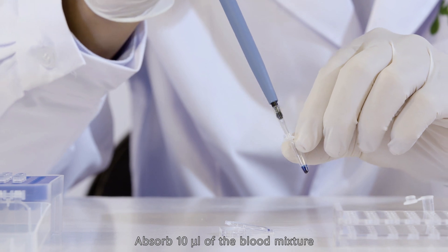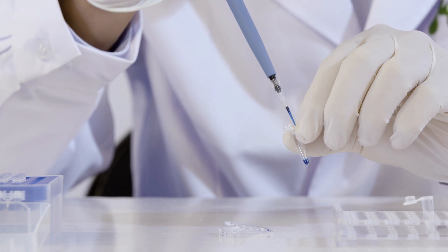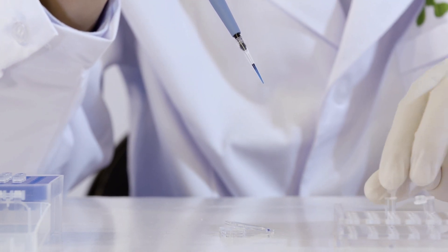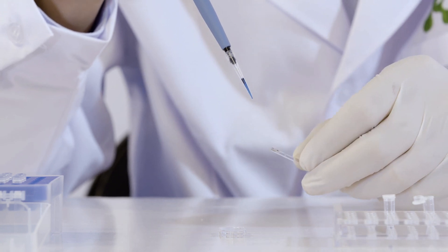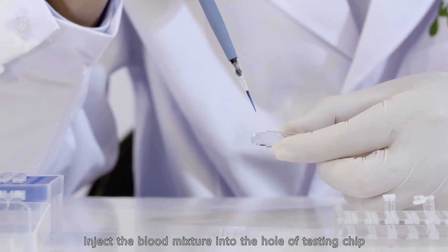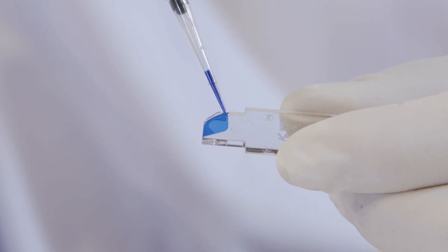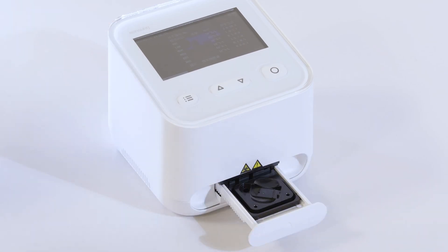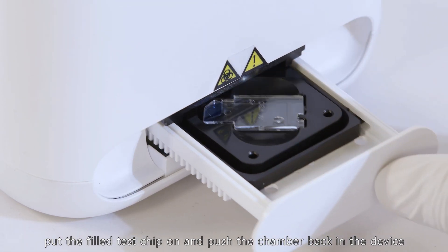Absorb 10 microliters of the blood mixture, paying attention to avoid bubbles. Inject the blood mixture into the whole of the testing chip. Open the chamber, put the filled test chip on, and push the chamber back into the device.